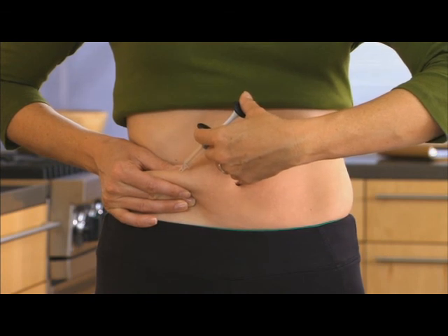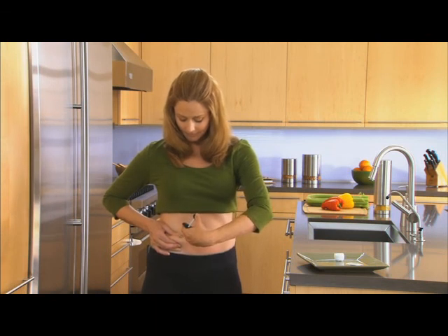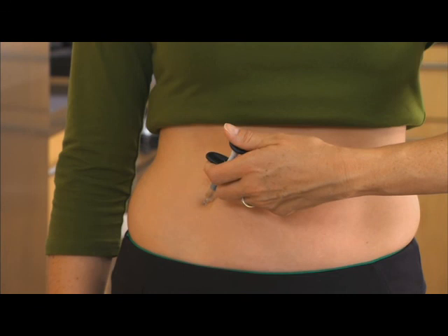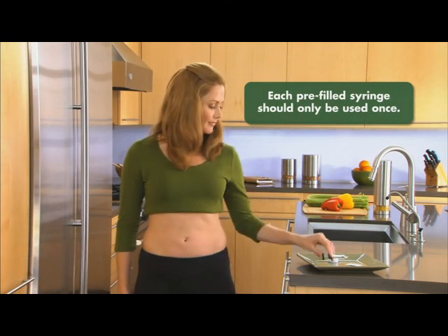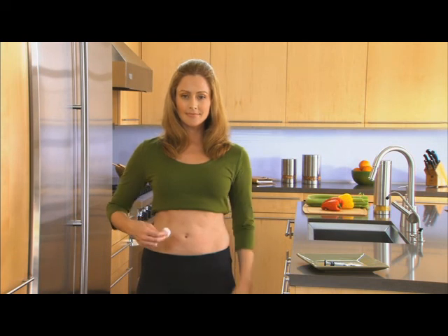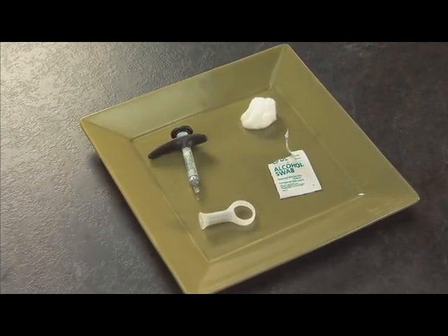Do not touch the needle with your fingers or let it touch any surface. With one quick, short motion, push the needle all the way into the skin. Push the plunger to inject the solution — it can take up to 10 seconds to empty the syringe. When the syringe is empty, carefully remove the needle from the skin at the same angle at which it was inserted. Release the skin with the first hand. Using a piece of gauze, apply pressure over the injection site for a few seconds. Do not rub the injection site. You may cover it with a small adhesive bandage if necessary.